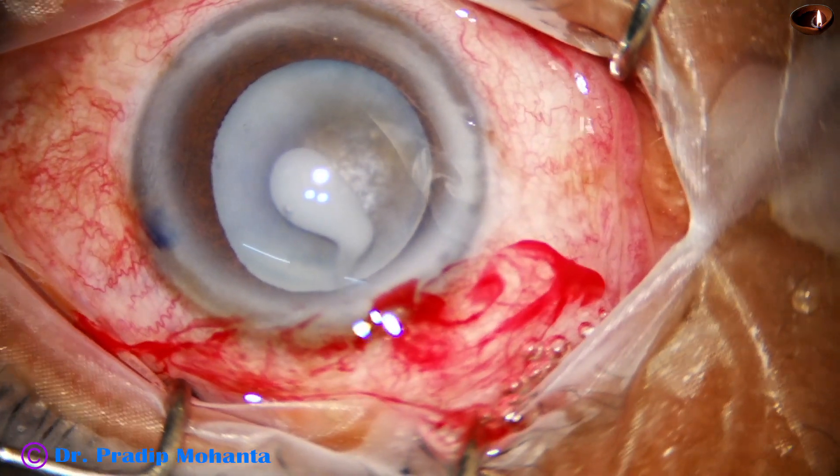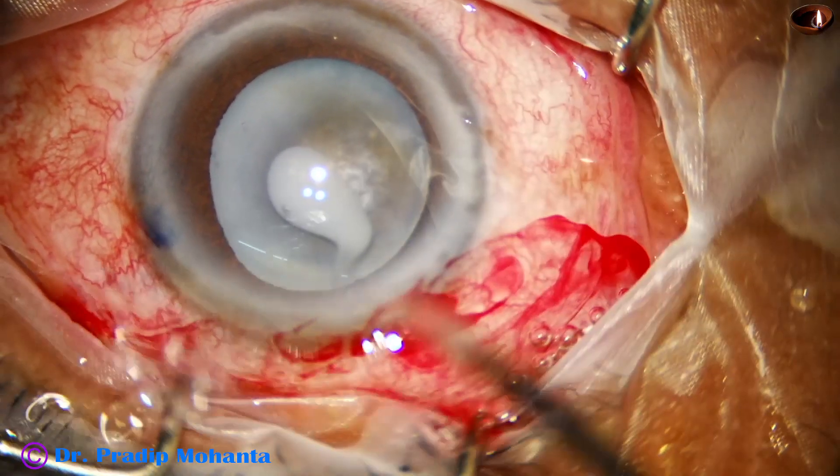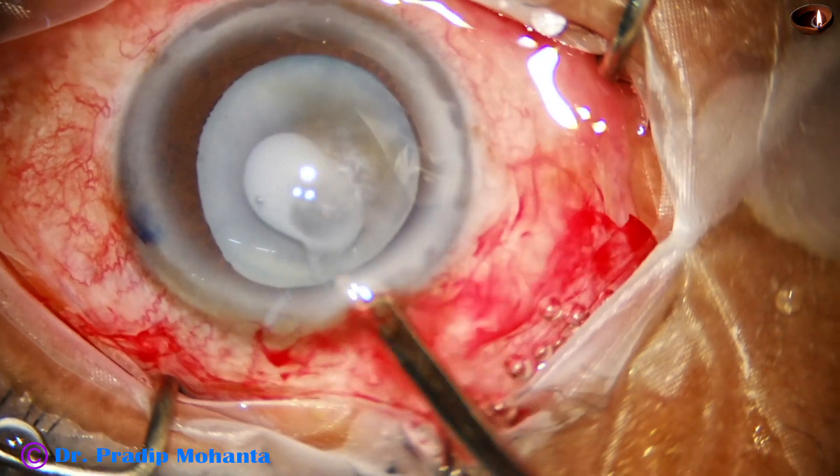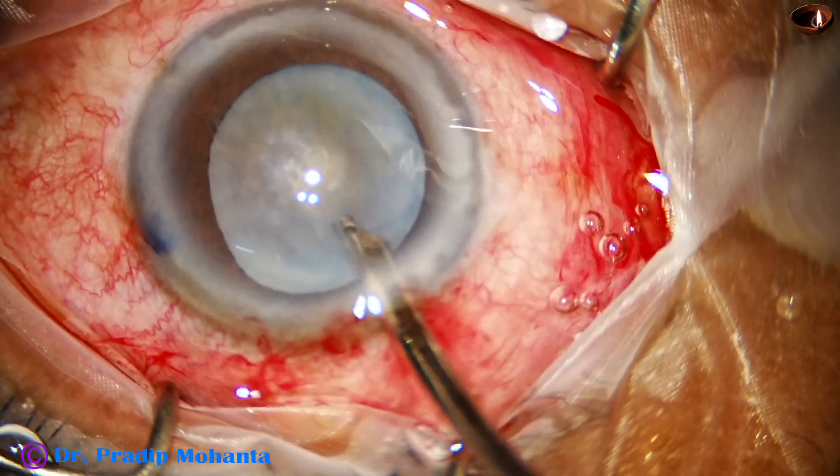The anterior capsule has been punctured with a sharp 26-gauge needle. Milky fluid comes out, and some of the milky fluid is aspirated.